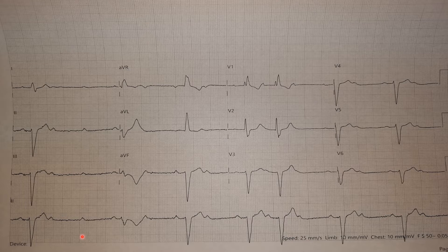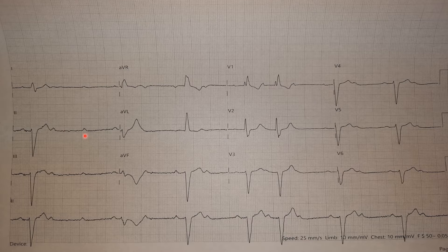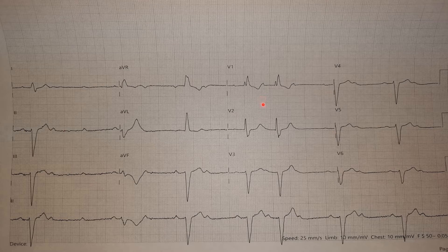Let us see whether this is an AV block or a sinus node dysfunction. First of all, we have to identify the P waves — this is a very important step, because sometimes AV blocks can be seen in tachyarrhythmias as well, like atrial tachycardias. So we have to identify whether these are P waves or not. They are upright in leads I, II, III, and AVF, negative in AVR, and positive in the inferior leads — all suggesting these are sinus P waves.